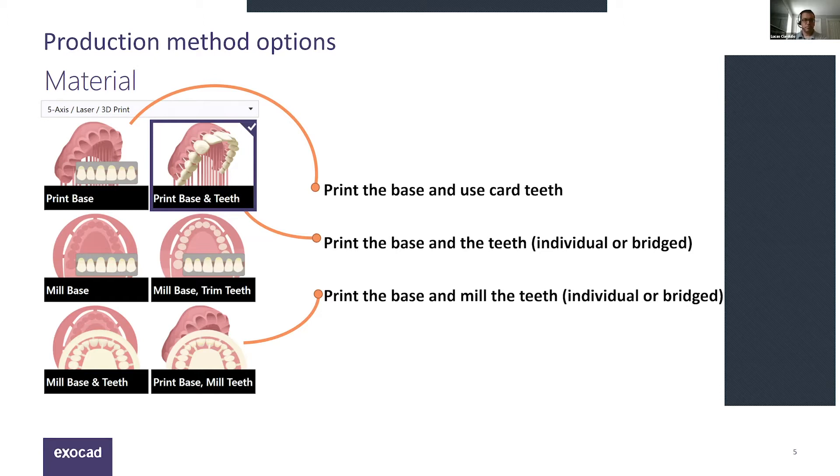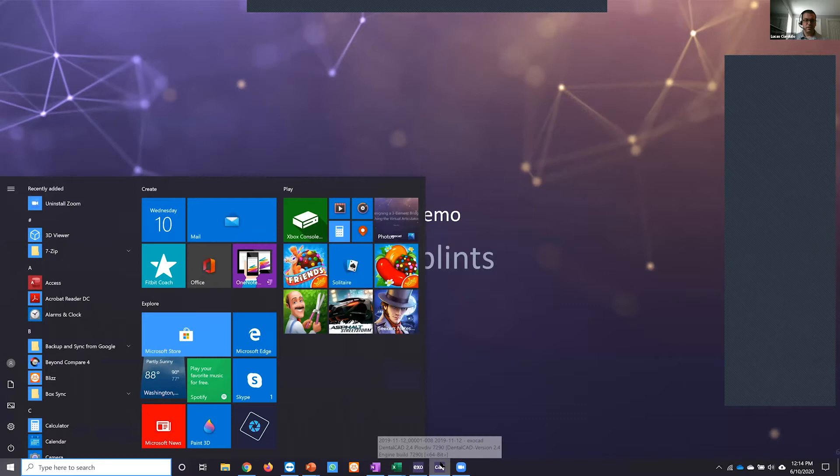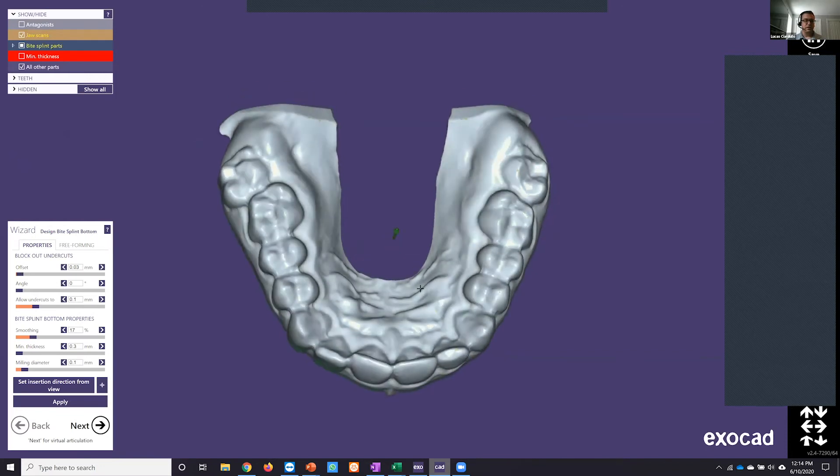Let's switch over to the CAD software for the live demo. The bite splint is already pulled up. ExoCAD has a really easy, intuitive, quick-to-learn interface — the main toolbar is on the right side, and the lower left corner has the wizard, which prompts us through the design process. Our first step is to set the insertion direction for the splint and then set parameters that control the fit and underside of the splint.